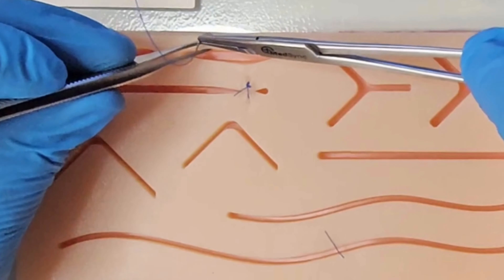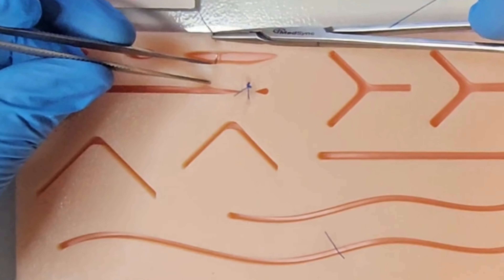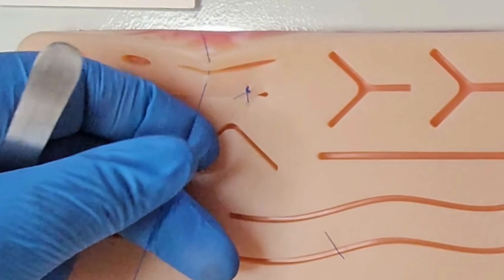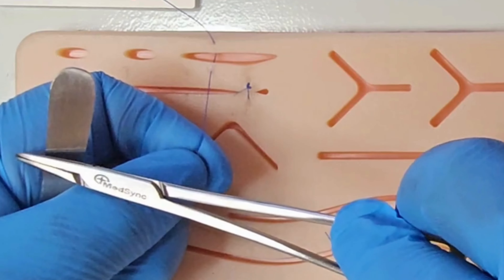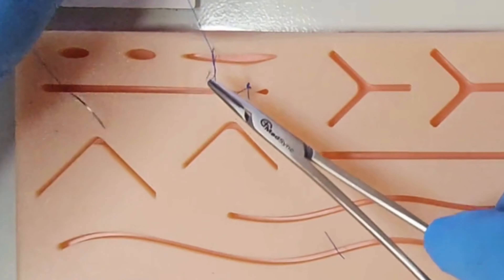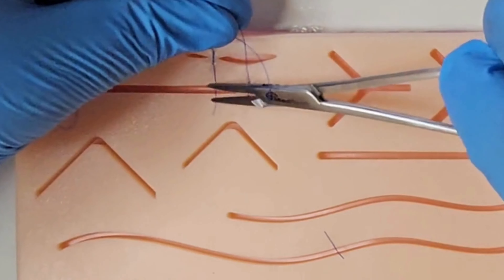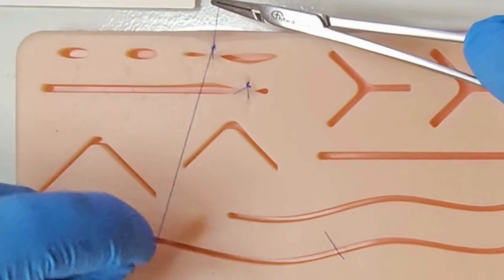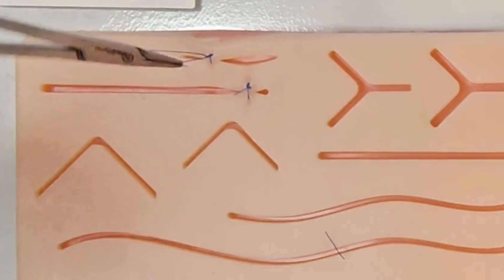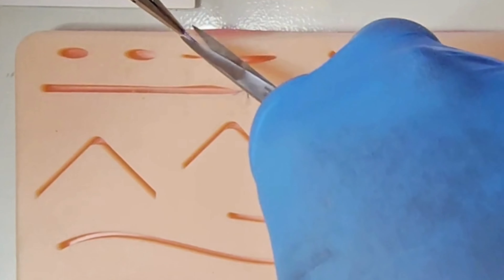The second option is to achieve wound approximation whilst tying the second, reef knot. Tie your surgeon's knot, followed by your reef knot, but as you pull the short end through the loop, pull only the short end until the wound is approximated to your desire. Then add tension to the long end until the knot is fully laid down.